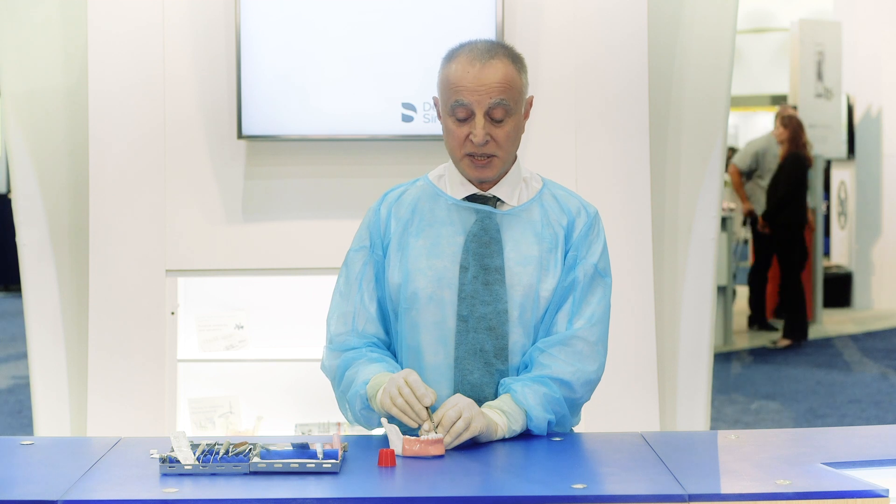My name is Yuval Ziberi. I'm a periodontist and I will demonstrate on a model the placement of O6 Plus and O6 Volumax.